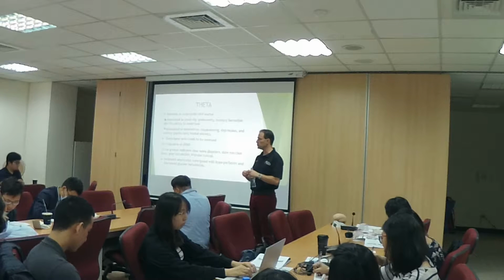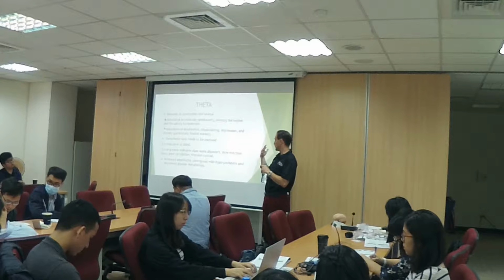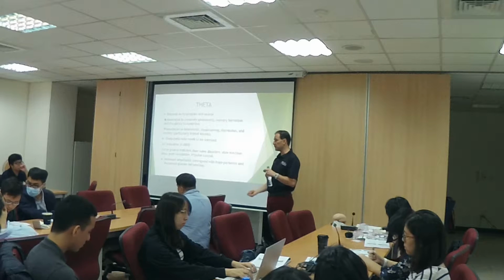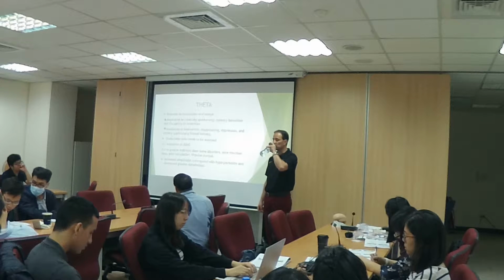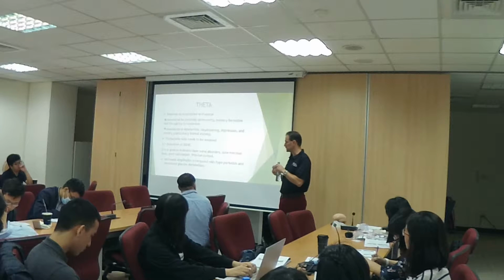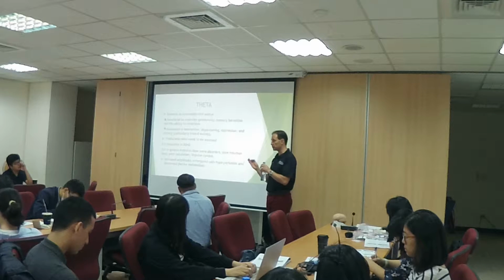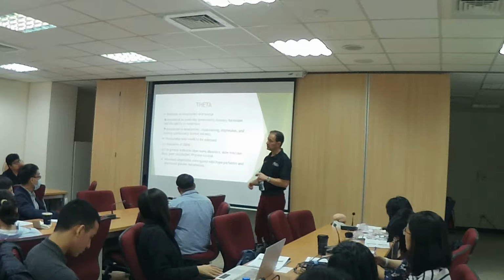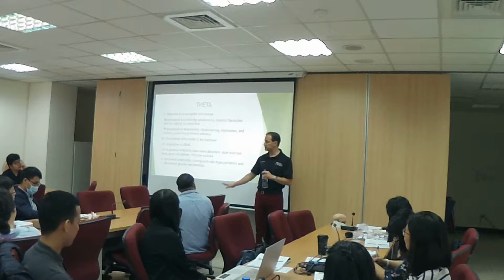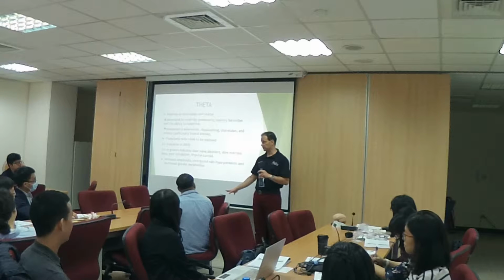Okay? And I'm talking to you and my brain's being stimulated by the fact that I want you to get this and understand what you're saying and learn something. Okay? So learning a language, exercising, playing an instrument, traveling to another country, all of those things are stimulation, and they always have to be implemented alongside neurofeedback. So don't expect that the client is going to come to your office for 40 sessions and they're going to sit there and do neurofeedback, and just by the mere fact of doing neurofeedback, they're going to get better.